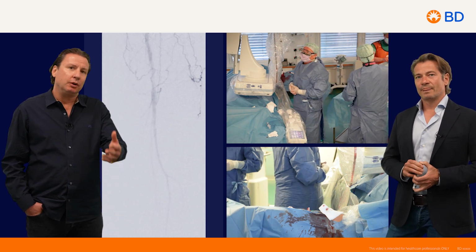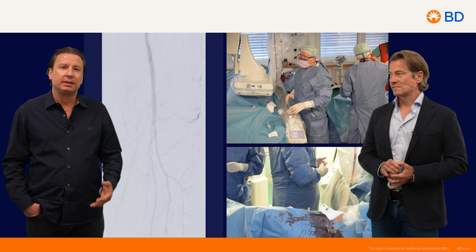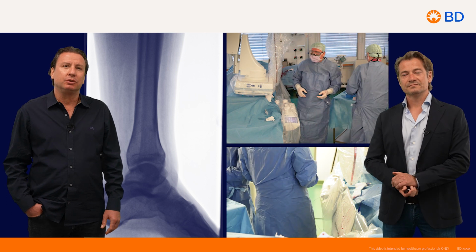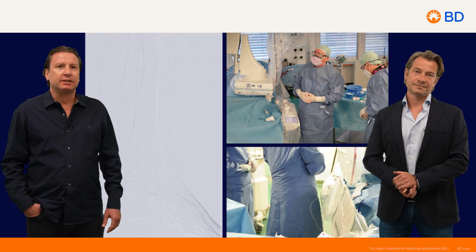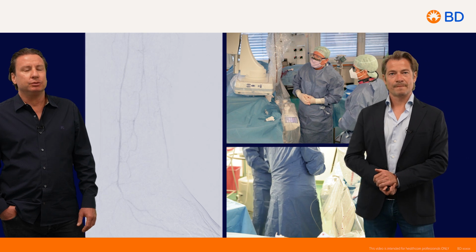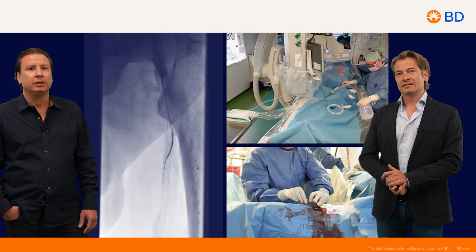Yeah, that's true. Of course, you can also do another puncture here, either crossover or even antegrade. As said, this patient was so obese. I think antegrade puncture is not safe in this case. So crossover. The groins were also not the cleanest, so that's why we decided to do the whole procedure from the arm, just to see how deep we can go at the end.